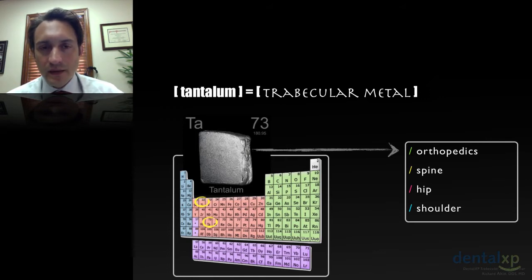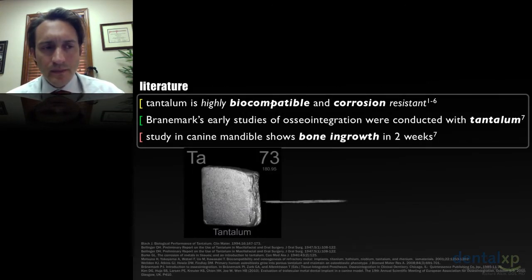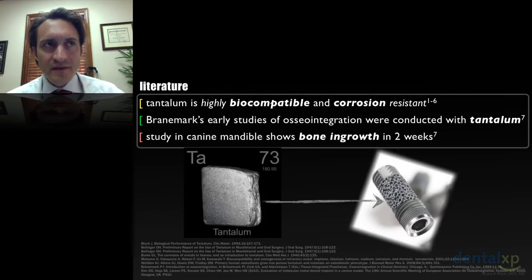background in orthopedic literature. And make note that tantalum is a very biocompatible and corrosion-resistant metal. In fact, Brånemark's early studies of osseointegration were conducted with this material.